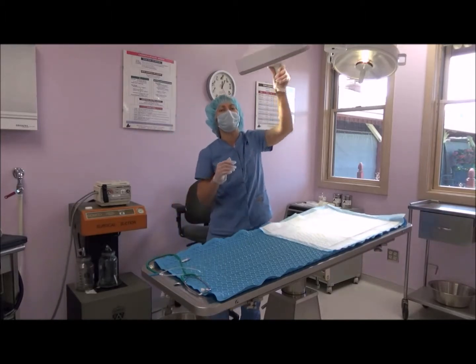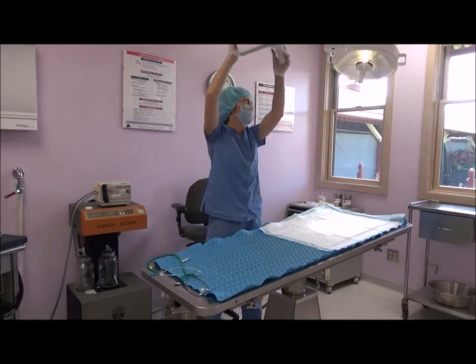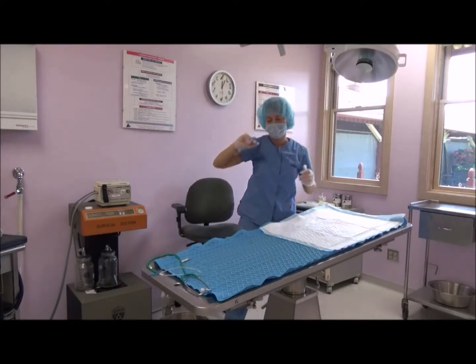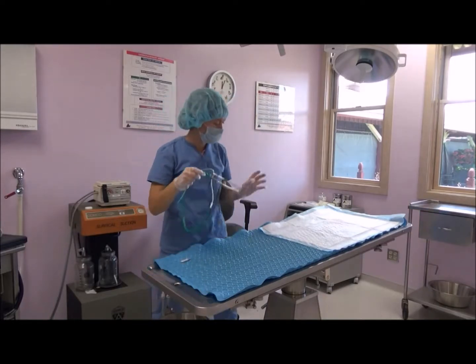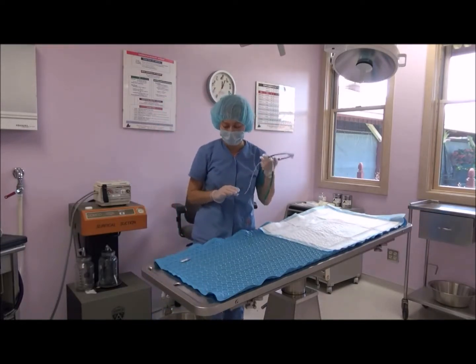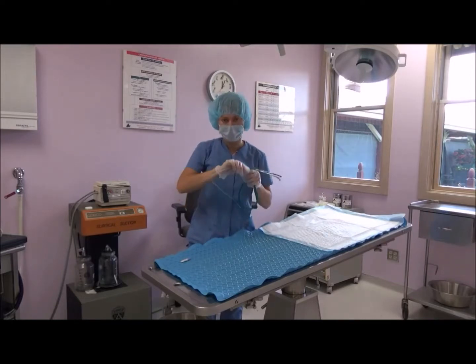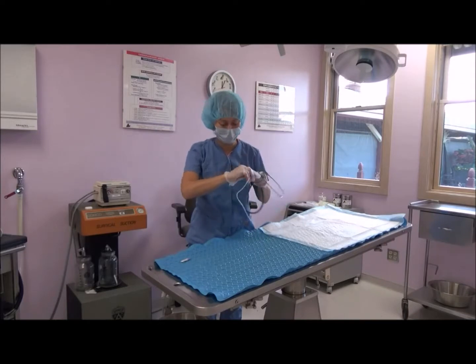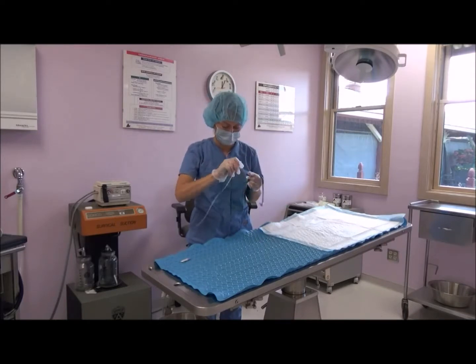I'm also going to turn off the lamps here. I'll take care of any other materials in here that I can dispose of or put away. Our esophageal stethoscope, I'll put this away, and also the tube portion in our chlorhexidine solution.